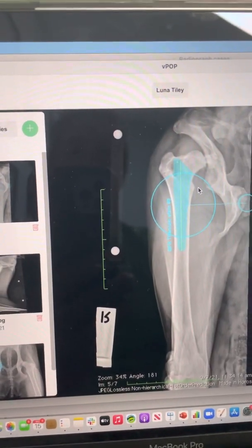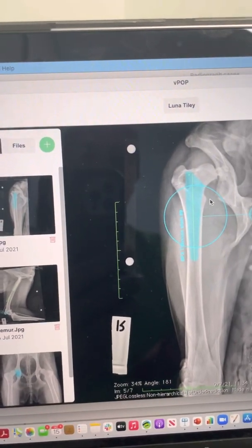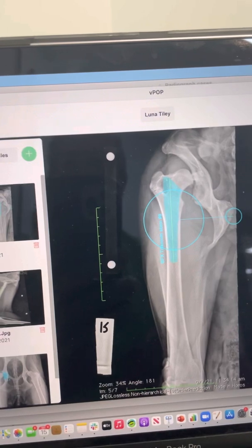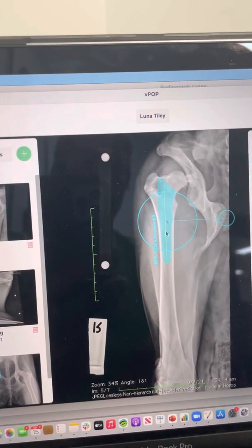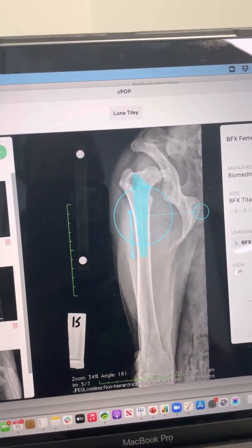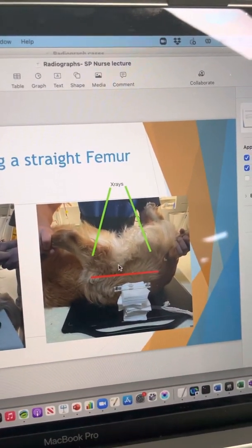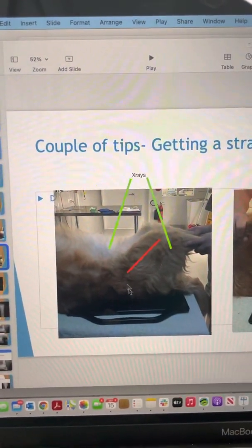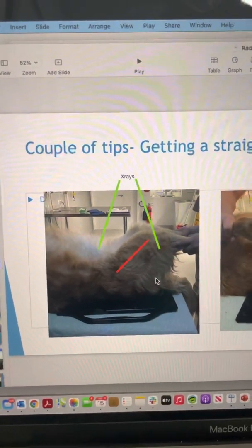So a couple of things to take away. First, the calibration markers and why they're important in terms of being positioned at the same distance from the plate as the area of interest. Second, taking a nice straight VD x-ray — what we're looking for. And if we want a really nice straight shot of the femur, remember that trick of pulling the femur cranially to take a caudal-to-cranial view, rather than struggling to extend the hip and get the femur parallel to the plate or perpendicular to the x-ray beam.